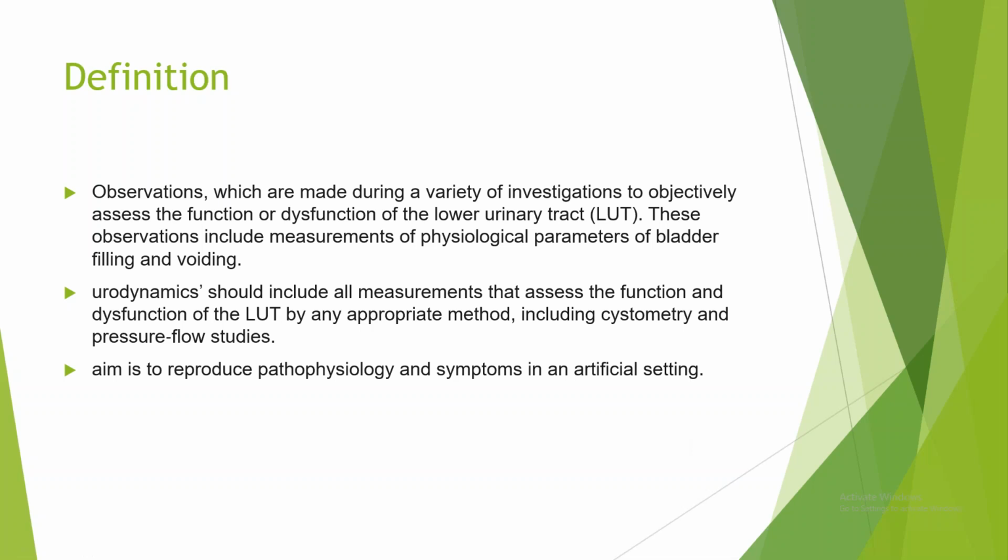Okay. So first and foremost, what is the definition? Actually, I have compiled it from the recent TOG on urodynamics and all other material from part 1 and part 2, which is available for us, and some stations and some urodynamic graphs also. So the definition is from TOG. This definition seems very difficult, but when we split it into 3-4 parts, it becomes very easy to remember. So what is it?